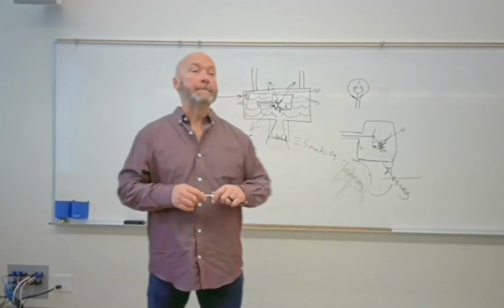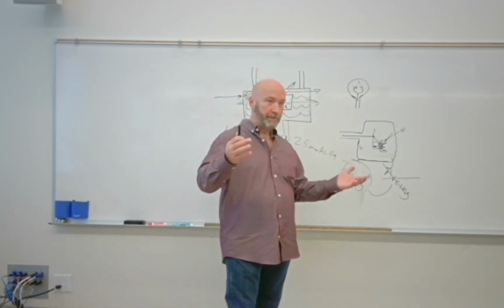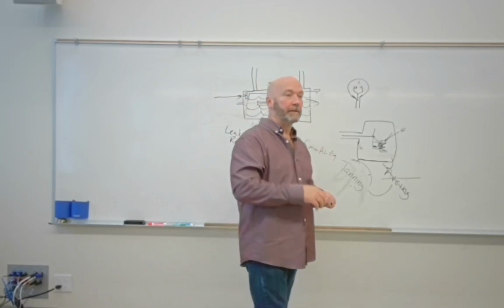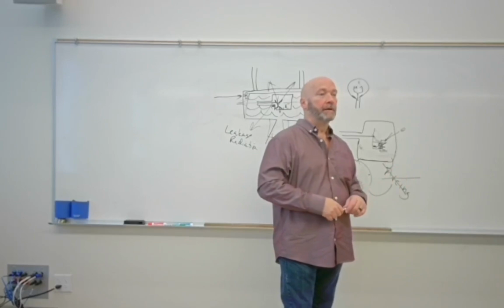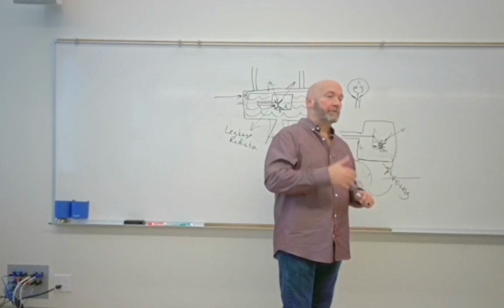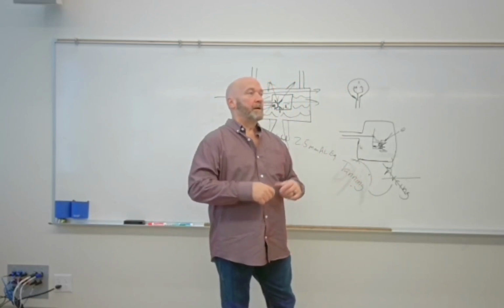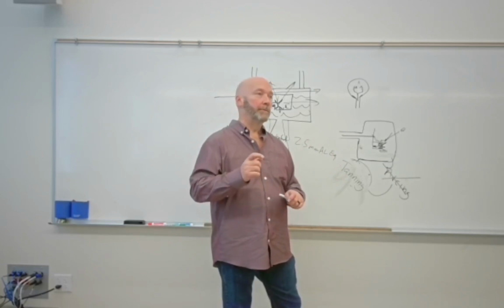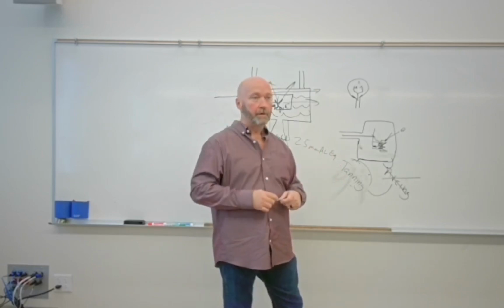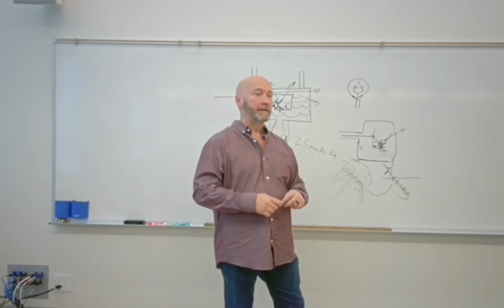The big and little: the big one, the large focal spot, the large filament is for large exposures. So if you're taking a KUB on a patient, you would naturally want to use large focal spot, because KUB is going to be a large exposure, and plus you're just not going to see a whole lot of detail in a KUB. Small would be for like extremity work, skull work. You're looking for fine bony detail, trabecular markings, things like that. Okay.